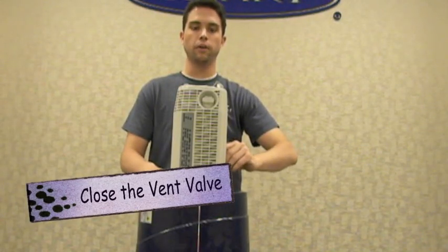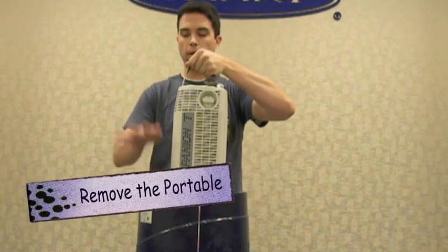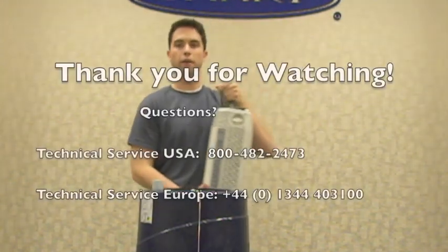Immediately after you hear that sputtering noise, close the vent valve, grasp the companion by the handle, and use the pop-off assembly on the liberator to pop the unit off. Now you're ready to go.